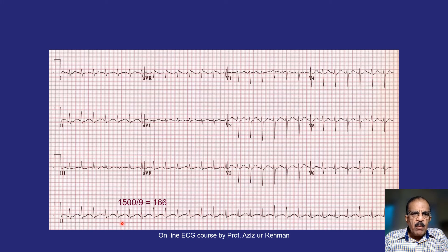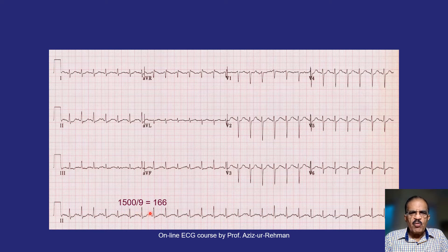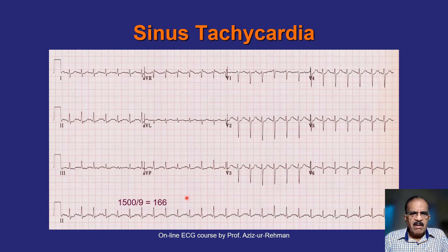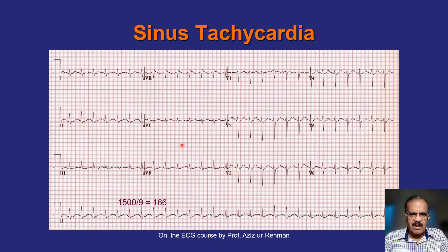The RR intervals are regular with nine small squares between adjacent R waves. Using the formula 1500 divided by 9, the heart rate is 166 beats per minute. Since 1500 is the number of small squares per minute, this gives us the rate per minute. The heart rate is clearly more than 150. With visible P waves and narrow complexes, this is sinus tachycardia — possibly due to high fever, hyperthyroidism, or anxiety.